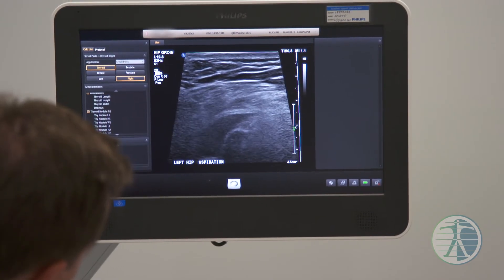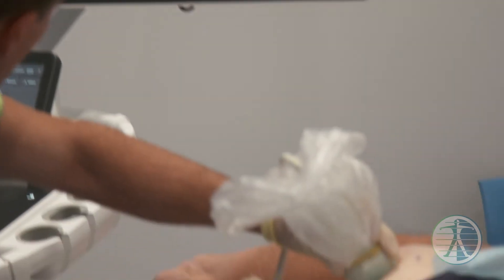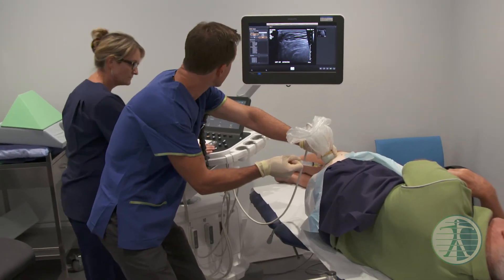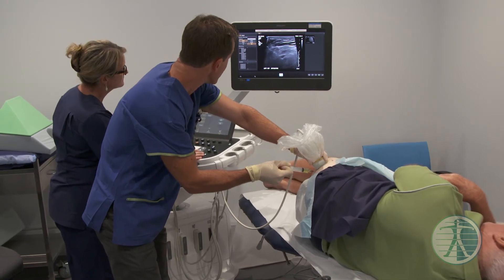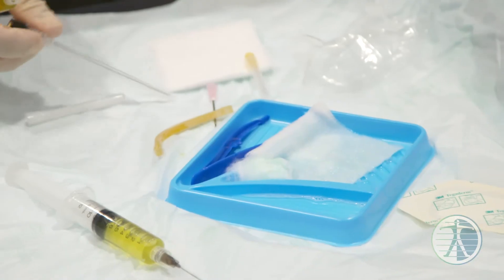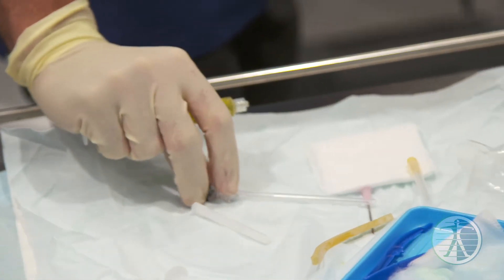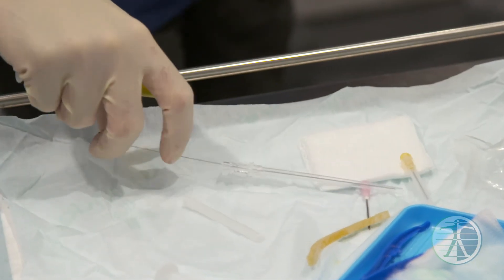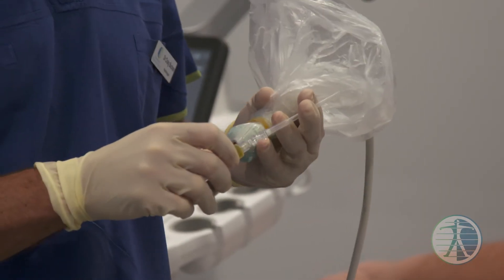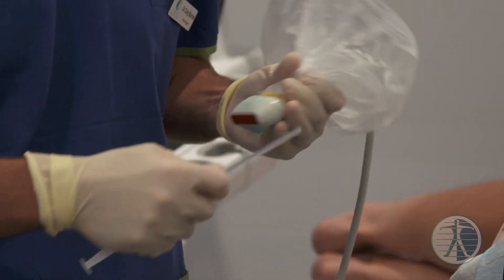Sorry, that just stings a little bit. Now Randall, I'm getting like maybe five mil straightaway of straw-coloured fluid — that shouldn't be there, that's abnormal, so getting rid of that in itself you'll feel better. There's some fluid that's accumulated in a potential space.